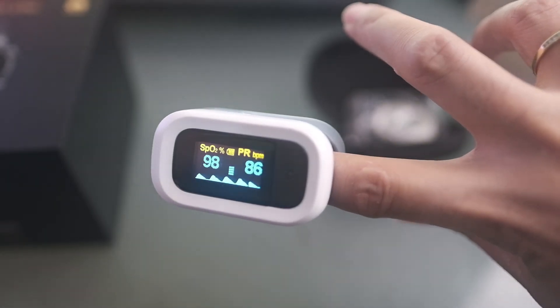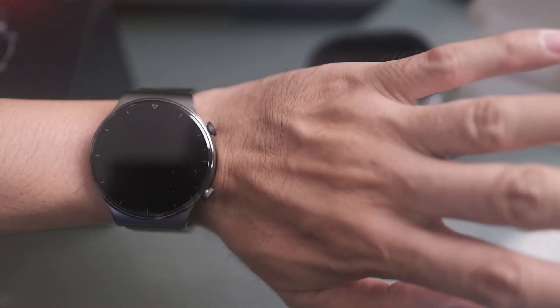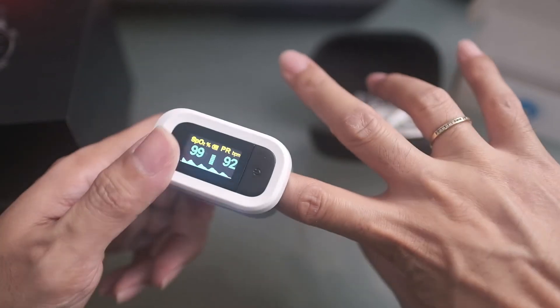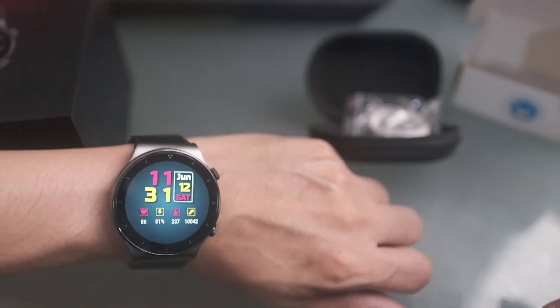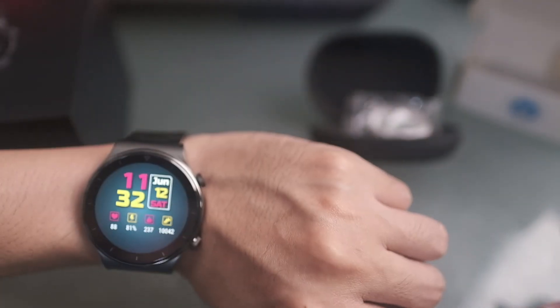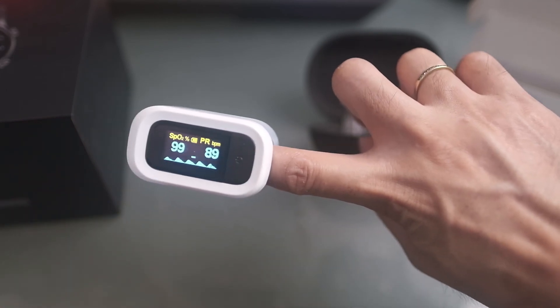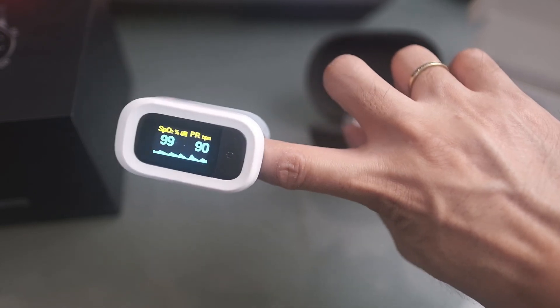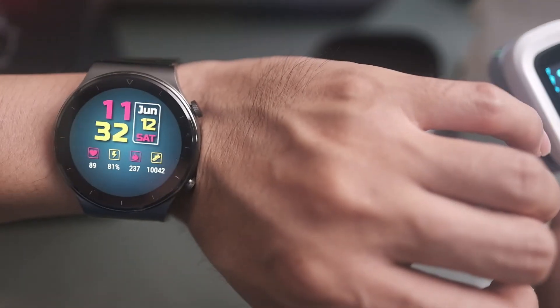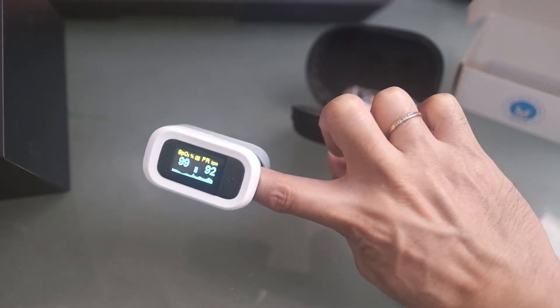The results are actually pretty close. With a smartwatch you should expect about a three to five percent discrepancy compared to a medical-grade pulse oximeter. For everyday routine testing the Huawei GT2 Pro works well since it's conveniently on your wrist. But if you need medical-grade accuracy, you'll really need to use a real-time pulse oximeter. That's the comparison of the Huawei GT2 Pro SpO2 test versus a medical-grade pulse oximeter. Thank you!